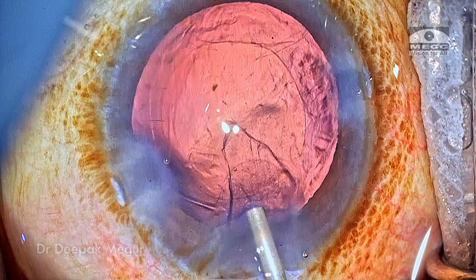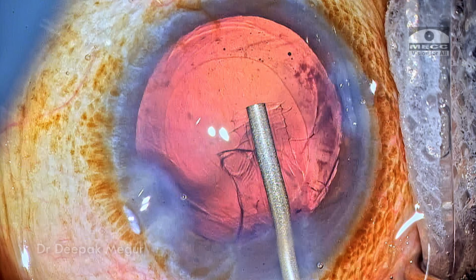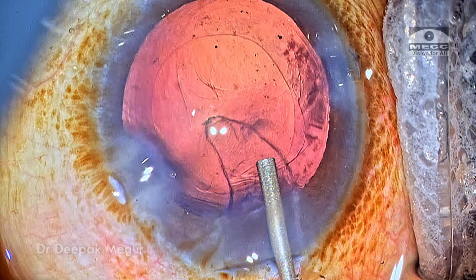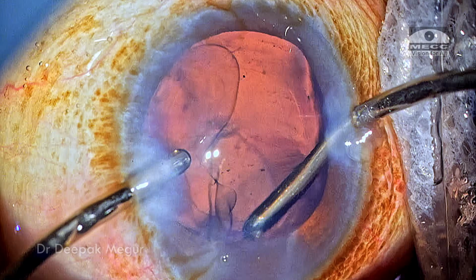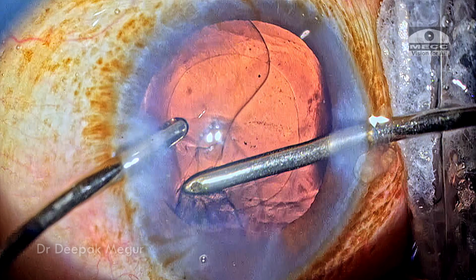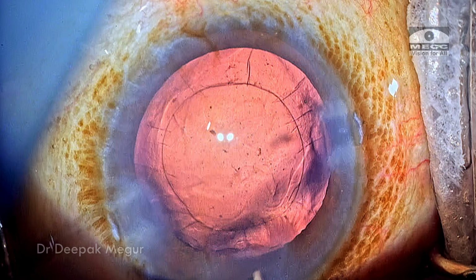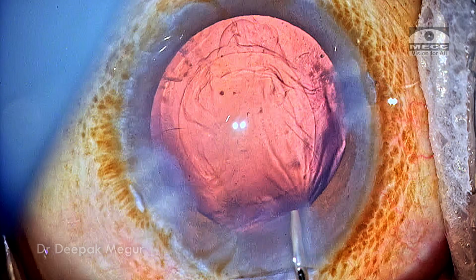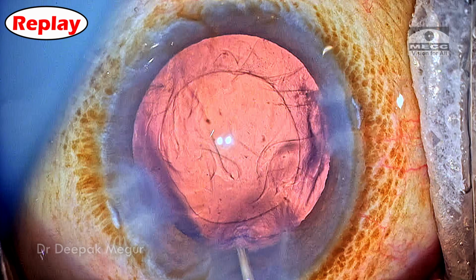So the solution to this is always to try to work with the bag very well formed. So I'm going to inject OVD, which is going to push back the posterior capsule and straighten out all the wrinkles in the bag, and then I'm going to venture to remove this remaining cortex. I'm just trying to flush the posterior capsule to clean off some of the fibers, but we can see that the wrinkling in the posterior capsule is so exaggerated.